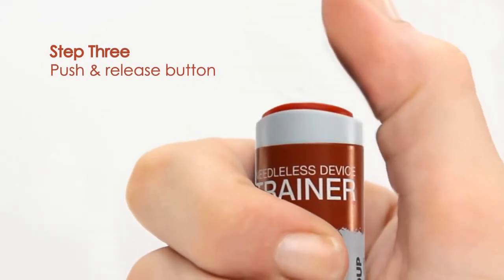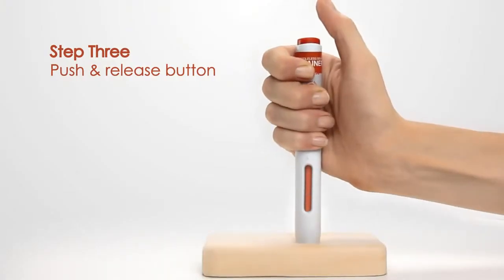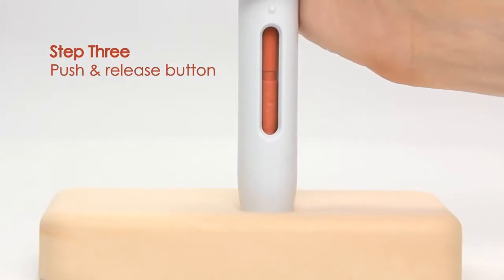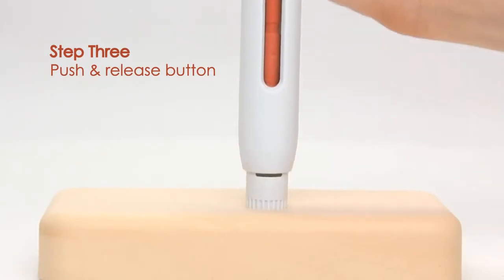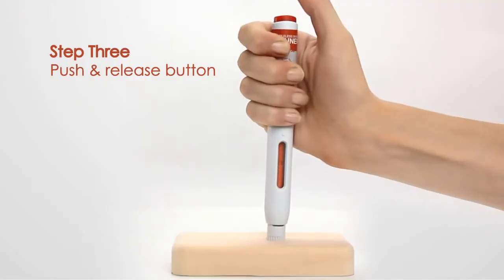Step 3: Push and release the activation button at the top of the device to simulate delivery. There will be two audible clicks. The viewing window will change color and the needle cover will extend, just like a real device.